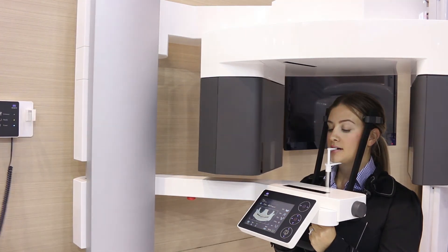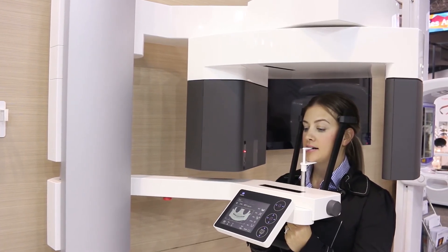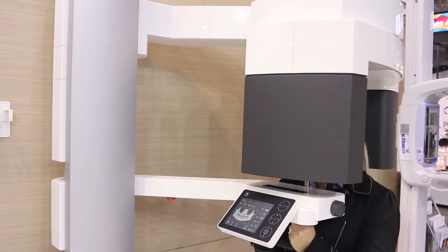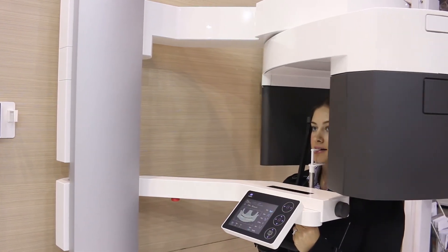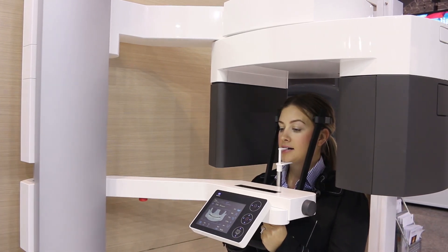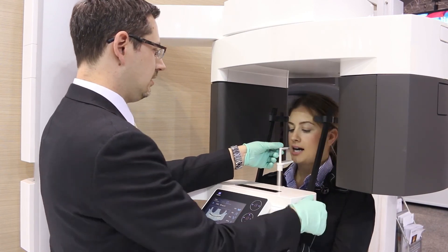You are now ready to acquire a panoramic image. Instruct the patient to remain still during the scan. Select the exposure switch and then press and hold the exposure button for the duration of the scan. Once the scan is complete, release the temple stabilizers and guide the patient away from the unit.